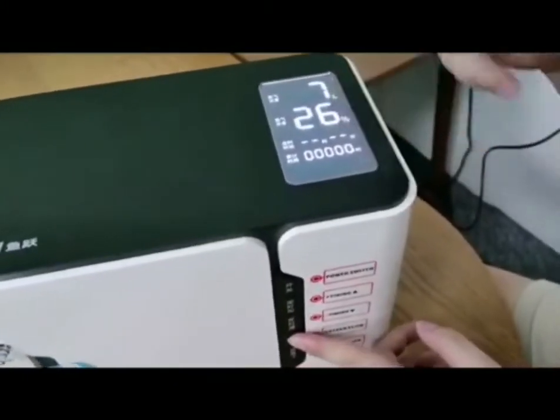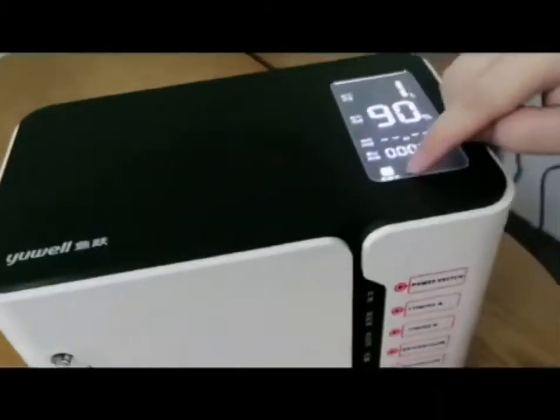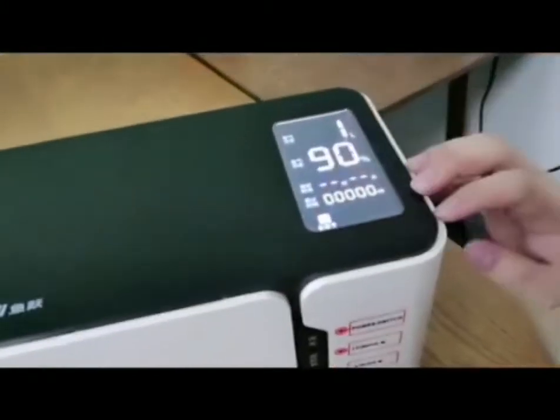You can see five liter and seven liter options. This is the icon of the ionizer.